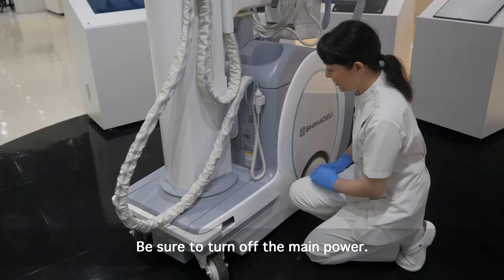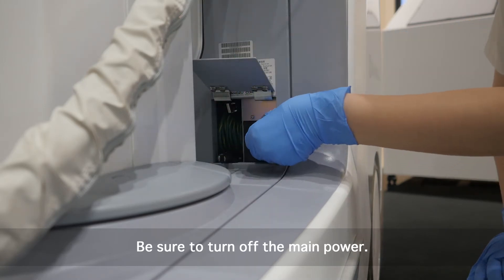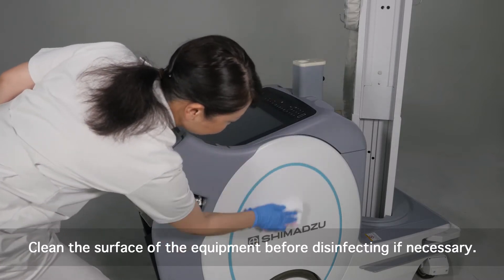Otherwise, a malfunction may occur in the system or the system may operate in an unintended way. Before using the disinfectant agents, clean the surface of the equipment.